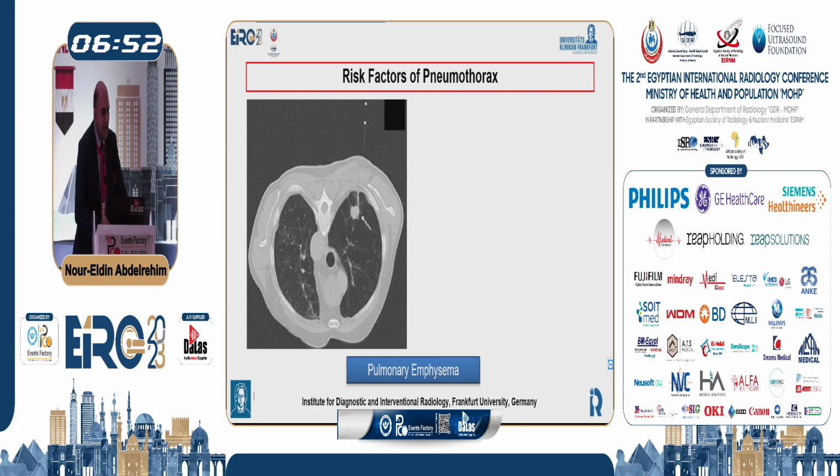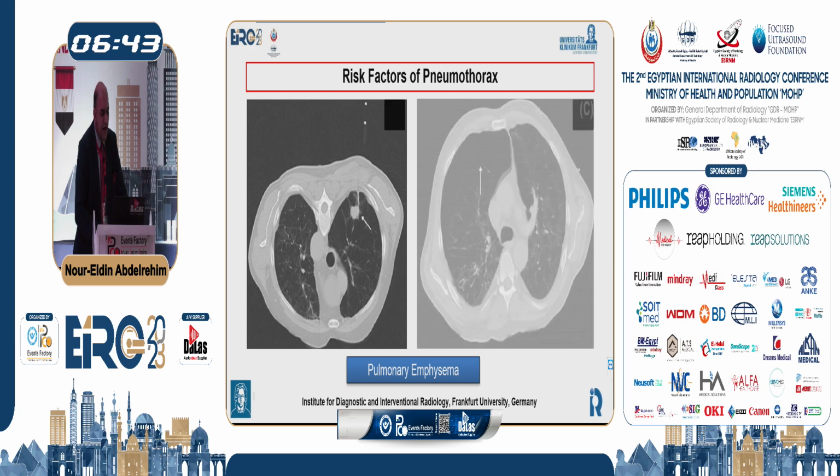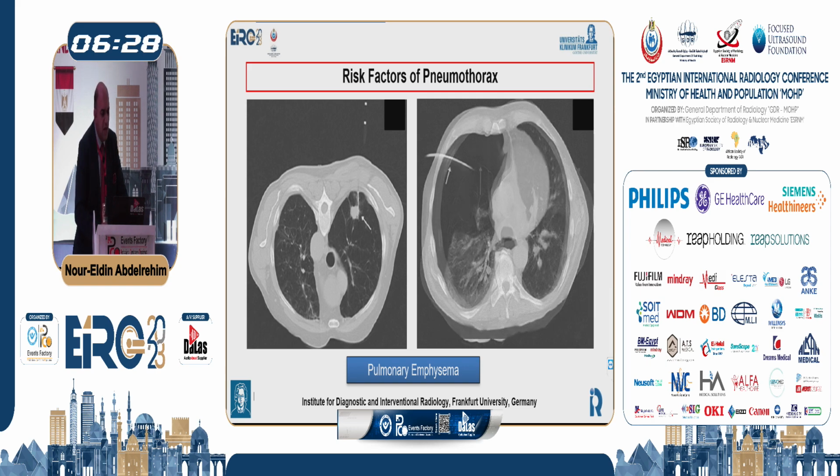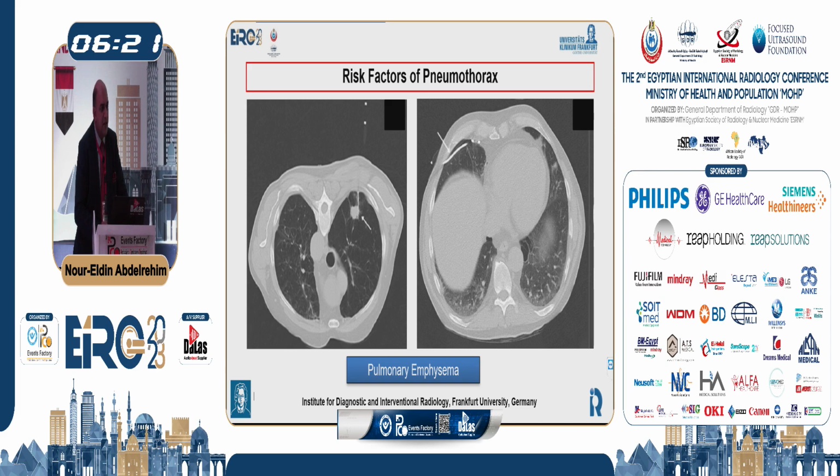This is a patient who had emphysema. Of course, you can see that the needle track inside the lung parenchyma is only 1 or 2 centimeters. However, the patient developed a large pneumothorax due to the emphysematous bulla in between. So how to manage it? Don't panic. You can insert an 8F pigtail catheter, and in this way do manual evacuation using a 3-way stopcock, and you can evacuate the air. So no problem in this case.